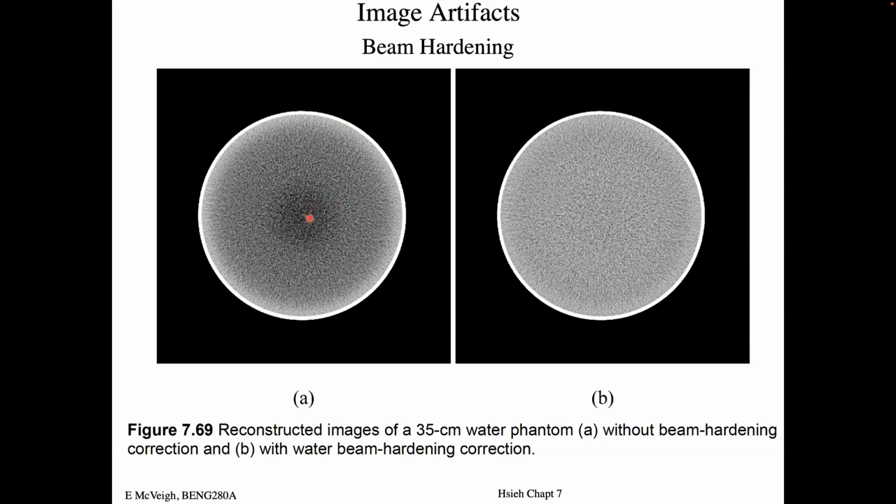It's because all of these pixels in the middle, the only beam they ever see has traveled through half of the phantom first, right? And so it's been hardened on its way to this location, right? Whereas these ones out here see the X-rays as soon as they enter. They also see X-rays coming across this way, etc.